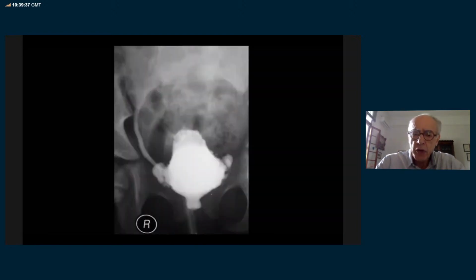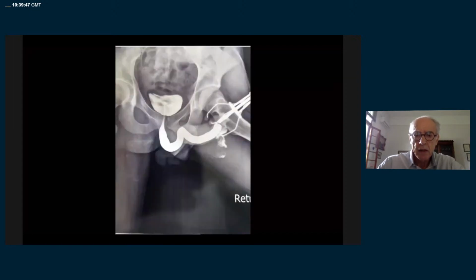In this image, we observe vesico-urethral reflux, diverticulum of the bladder, and dilatation of the posterior urethra. In this other image, we observe the bladder is over the posterior urethra. What happened? Probably the X-ray beam is at the wrong angle, because this angle causes distortion of the image.